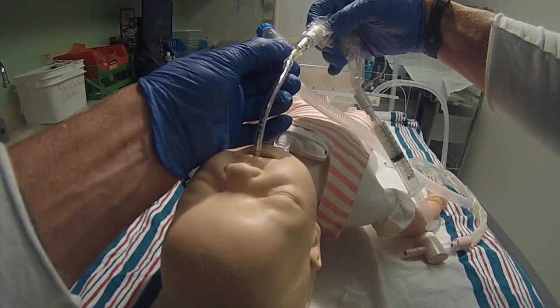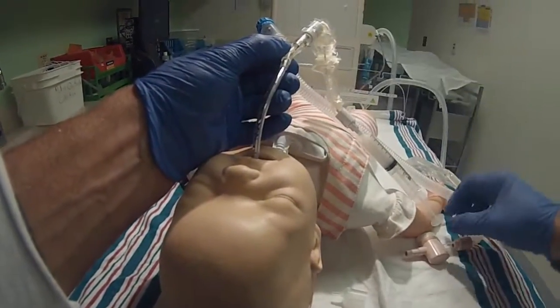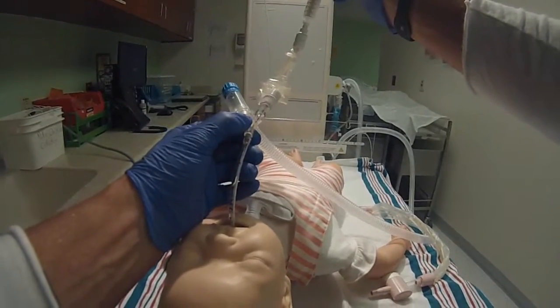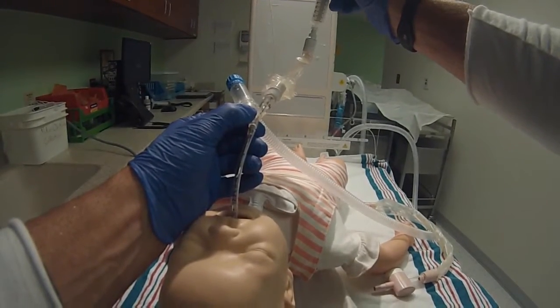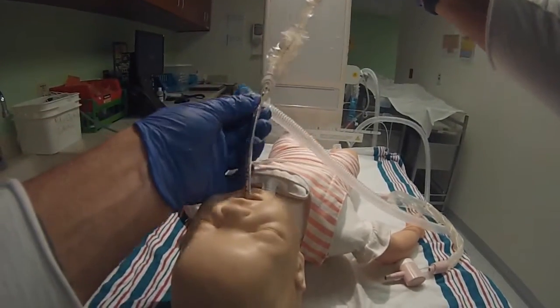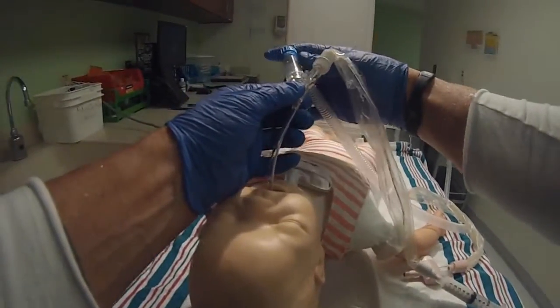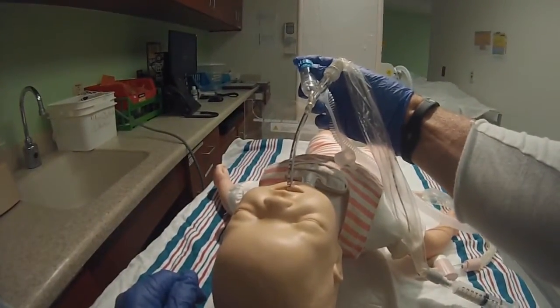I'm just going to slow down so I can show you. There's a 12 here to the 12 there — you're now perfectly at where you need to be. You're going to push this down until it goes to 3 mL's right here. Once you get to 3, pull it out and you're going to be continuing puffing like this for a minute.